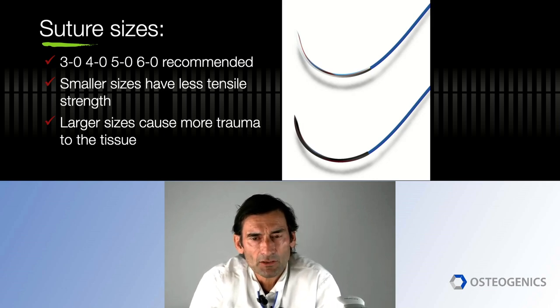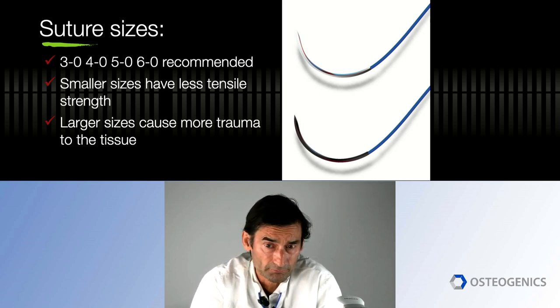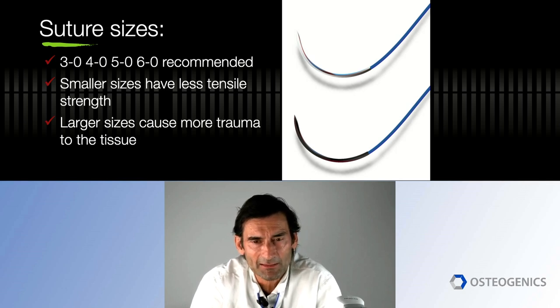Now let's talk about suture sizes because there's a lot of confusion, right? Even in my office, which is very specialized in surgery, sometimes there are boxes missing or needles are missing and then I have to get on the phone very quickly with Osteogenics or with Blake and say, hey, I have an emergency. I need some special sutures.